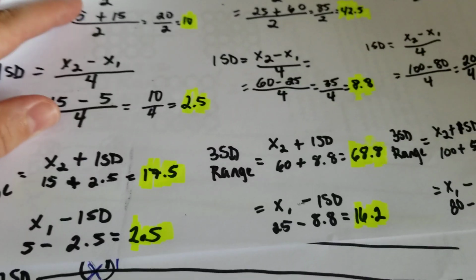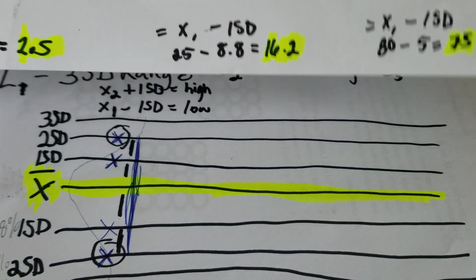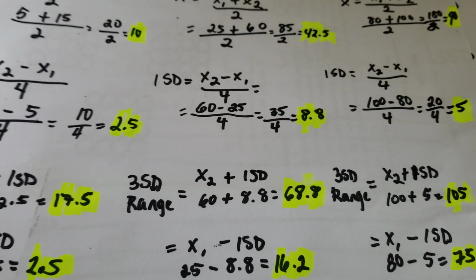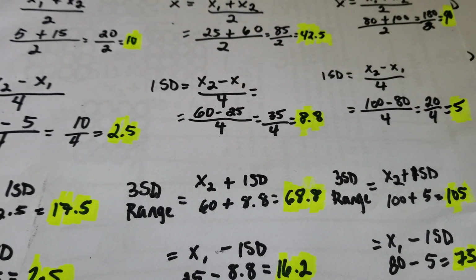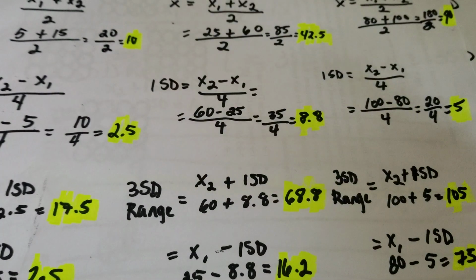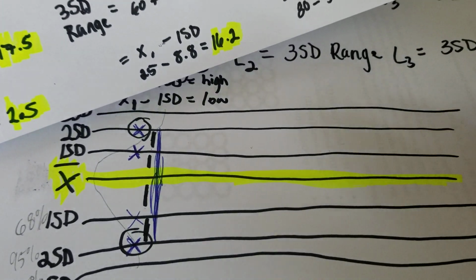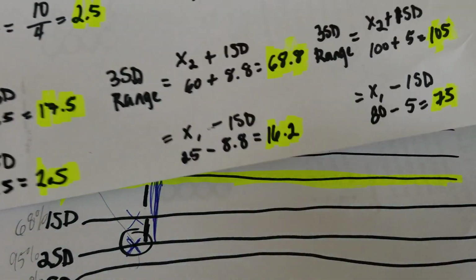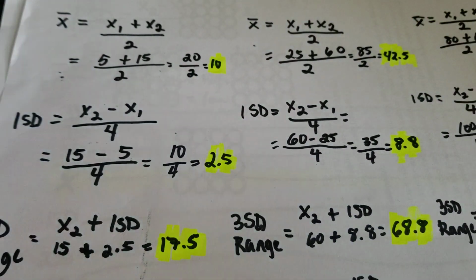They're all highlighted. And what we're now going to do is plot them onto the Levy-Jennings chart that we have here. So to first make a statement here, there would be a different Levy-Jennings chart for each level, but I have limited room. So we're going to put them on the same one, but plot the levels and separate them by a line. Okay. So for level 1, our mean is 10.